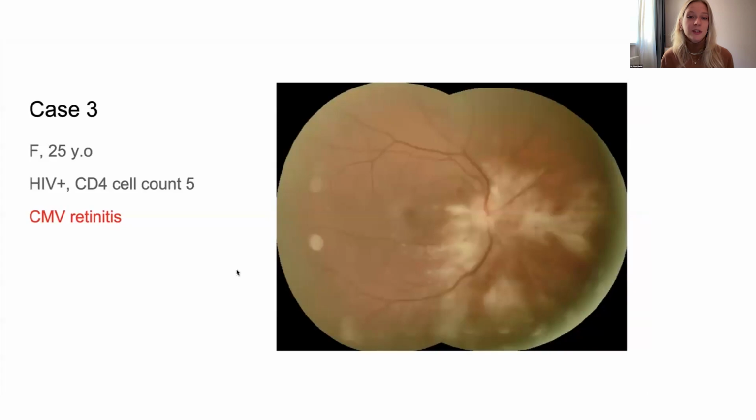And if this patient would be seen by the ophthalmologist initially, of course it makes sense, and even with the fundus lens, it can be easily detected. But in the resource limited center, if this patient is treated like an inpatient and cannot go anywhere, this fundus imaging helps a lot. So the infectionist again takes this picture, sends it to the ophthalmologist, and the treatment can be initiated right away. So it's not only about taking pictures, it's not only about setting the diagnosis, but it's also about saving the life of this patient with this screening tool.